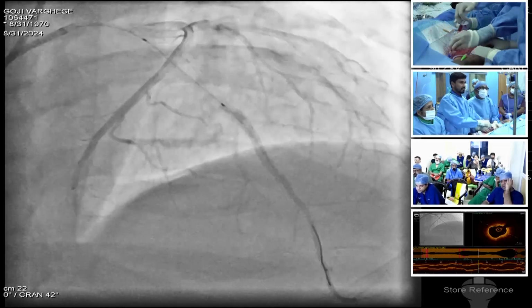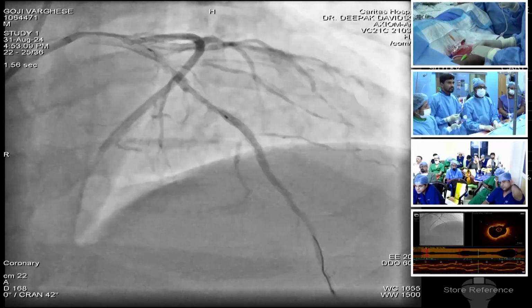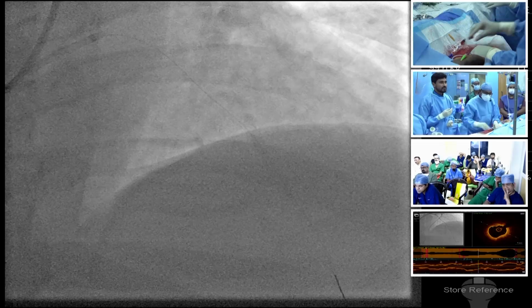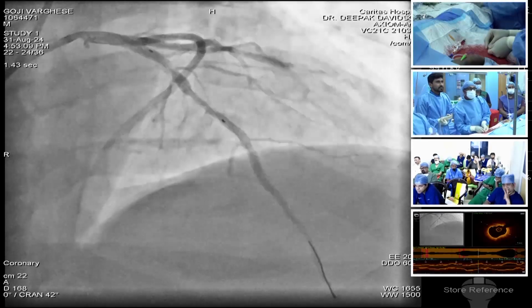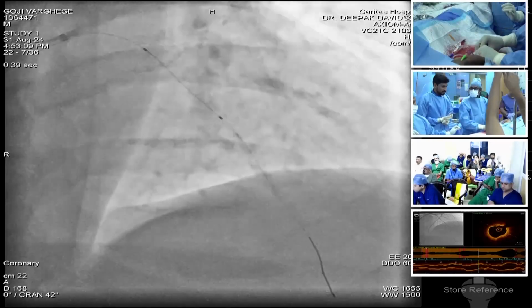Small cine. Okay, and so in the next 38, 3.5, 30. Distally, it looks reasonable. There is no dissection. Yeah, 30. Please run the previous run once again. We are just overlapping, and proximally also it looks reasonable. Yeah, 30.